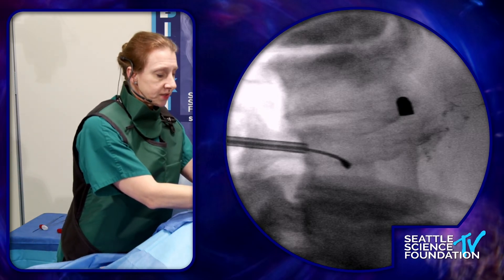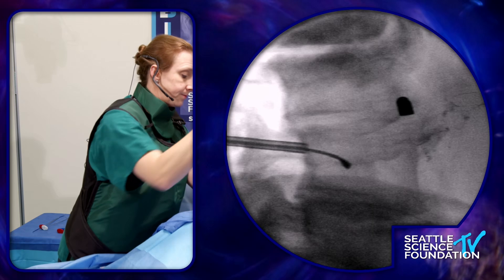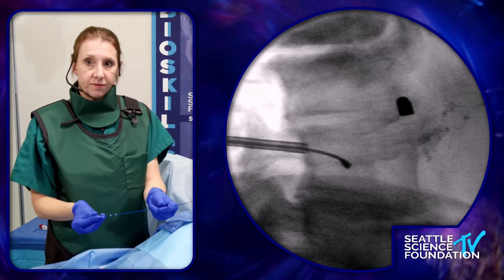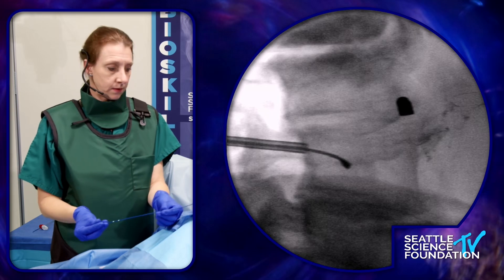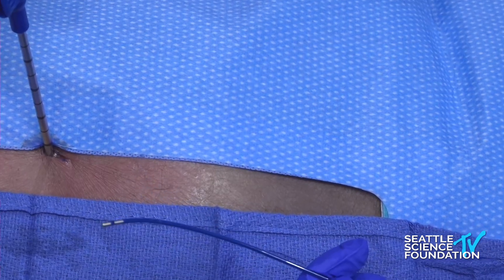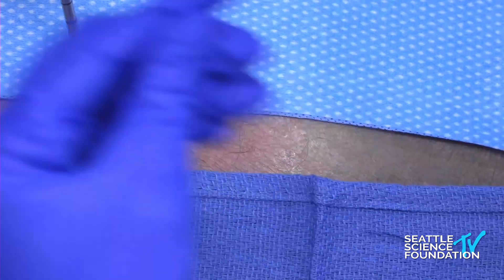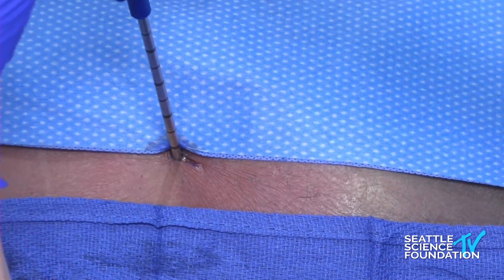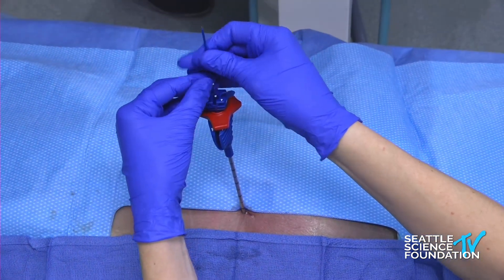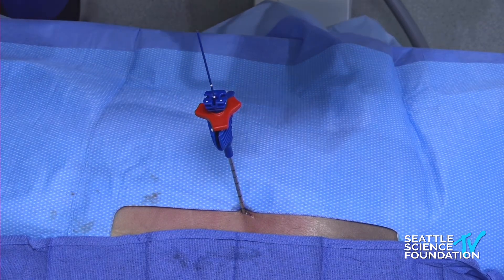What I'm going to do at this point is remove that J stylet and place my radiofrequency probe here. If you can see on the screen, you can see the two electrodes on the end of this probe. After moving my stylet, I'm going to replace the probe. There are some markings on the length of the probe so you know when it is leaving the end of the cannula.